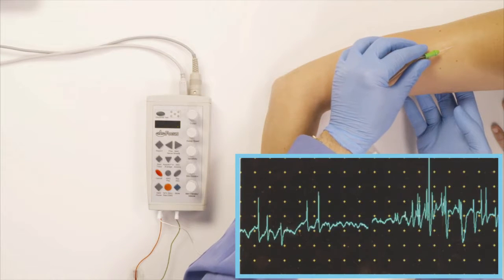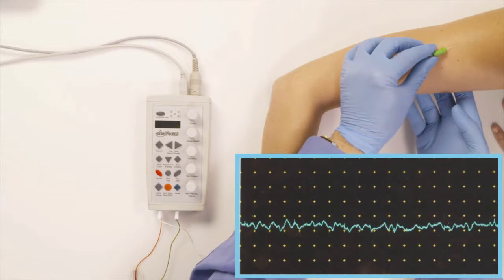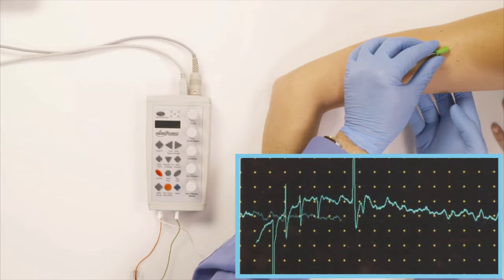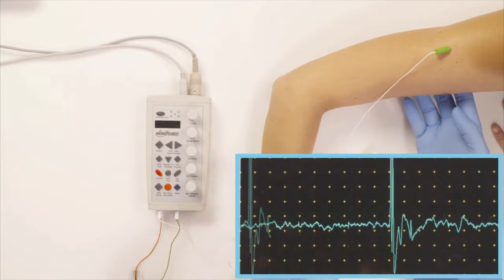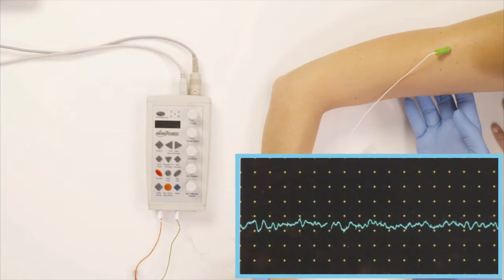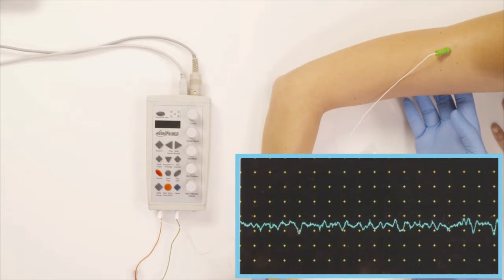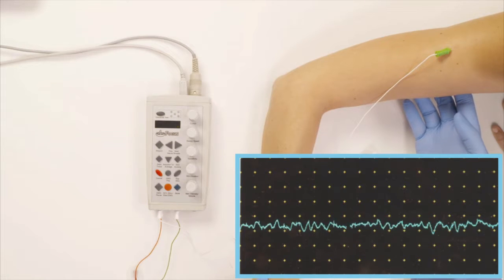And I'm gonna do some insertion, insertion, insertion, and the insertion is showing that the muscle stops contracting as soon as I stop the insertion.